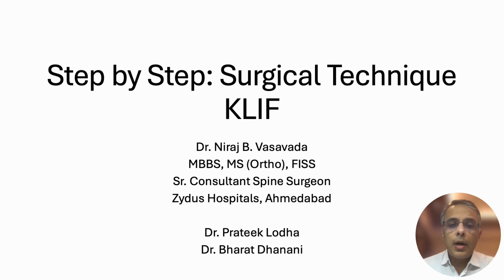Hello friends, I am Dr. Niraj Vasavada, consultant spine surgeon, Zydus Hospital, Ahmedabad. Today I am here to take you through the step-by-step surgical technique for Trans-Kambin lumbar interbody fusion.